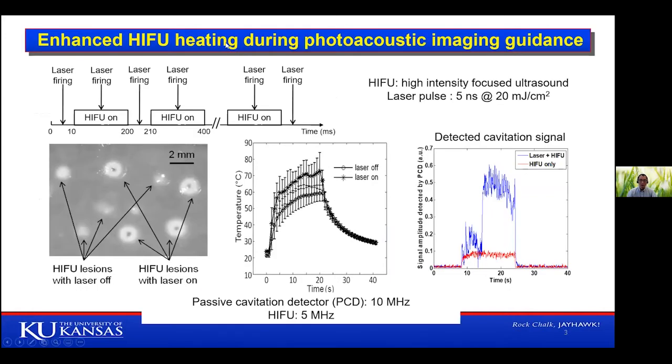This is some early results, how we actually started this technology. I was working on photoacoustic imaging and also on high intensity focused ultrasound, studying how to use photoacoustic imaging to guide HIFU. If you can see my cursor here, what we found is that every time we had the laser and the HIFU on together, we always had a bigger lesion. And in the middle, there's a black spot, which seems to be some cavitation.